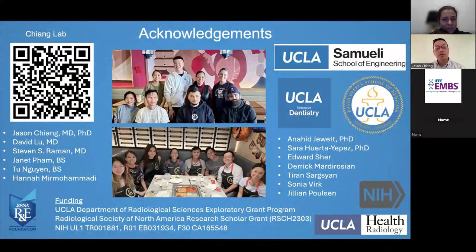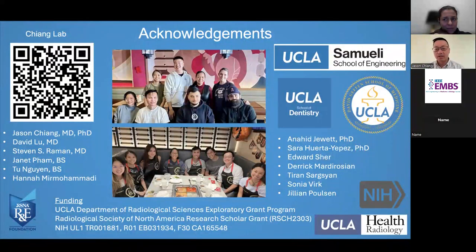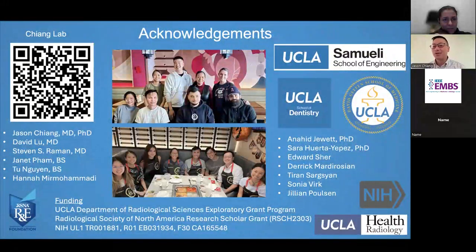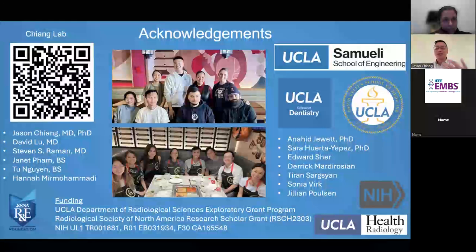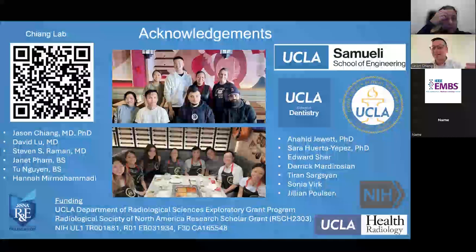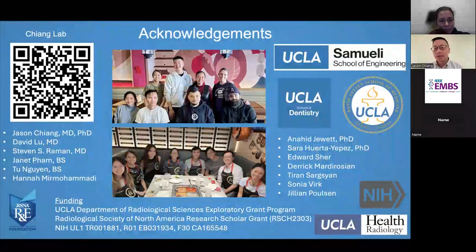The other reason I like ultrasound is you can see the microbubbles being formed from the heat being generated from the ablation zone. Now, the microbubbles are not an accurate reflection of how much heat is being generated. The ultrasound is just very sensitive to microbubbles. So you can have a lot of microbubbles, but it's maybe not that hot. But I use it as a way to, if the microbubbles are getting close to a critical structure, then I might slow down. I might turn down the power, or stop ablating and do a CT just to confirm where my ablation zone is.